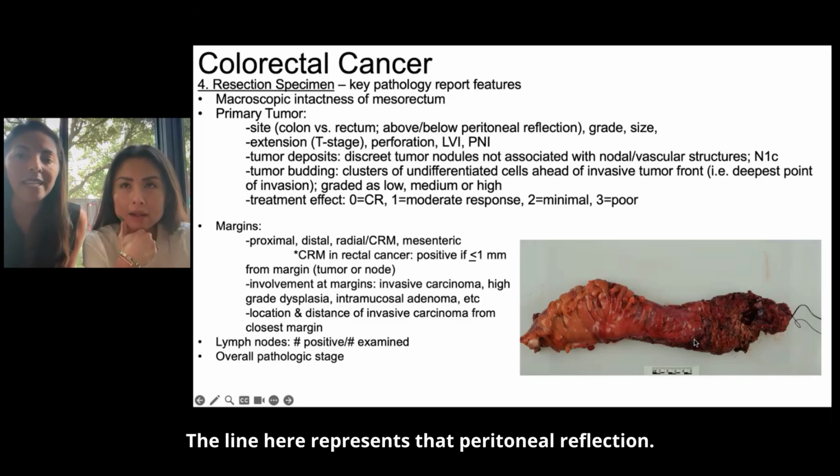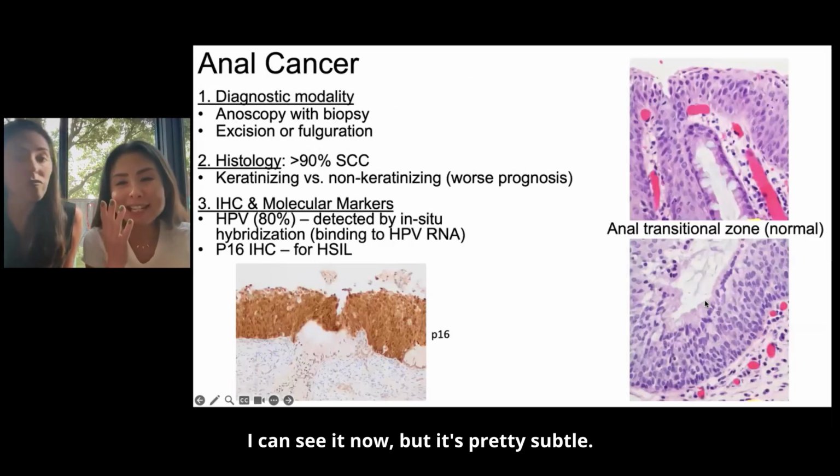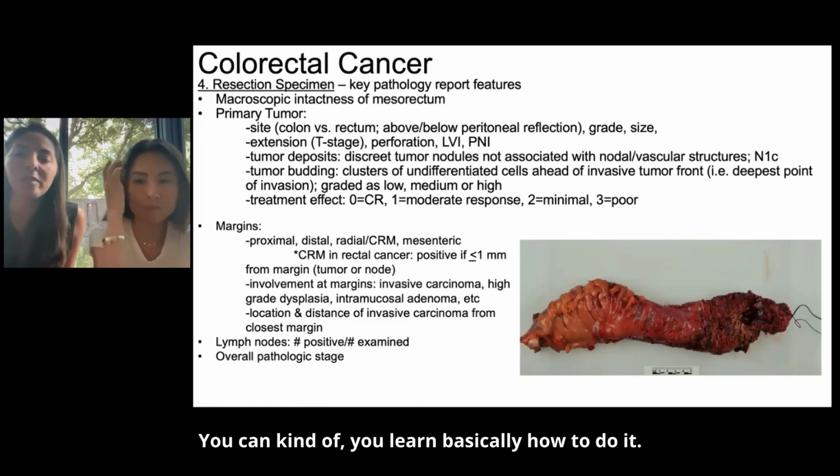And so this line here represents that peritoneal reflection that people refer to. I can see it now, but it's pretty subtle. Yeah, it can be pretty subtle. You basically learn how to do it.